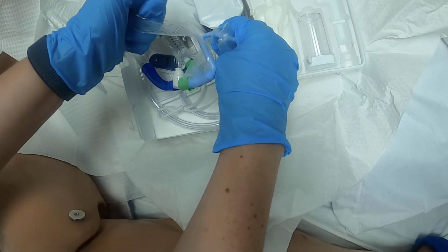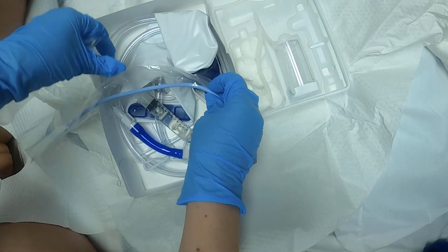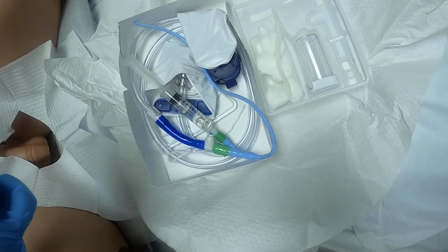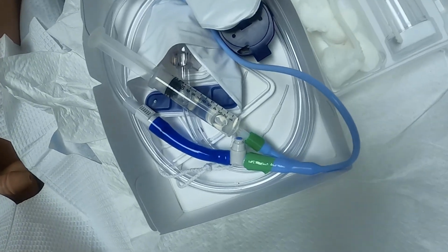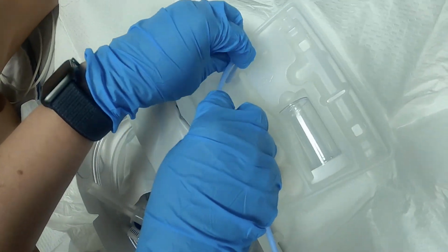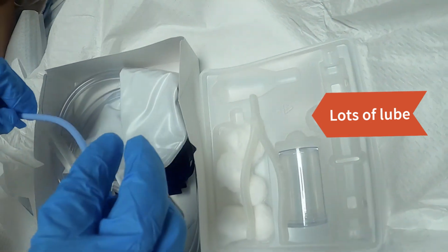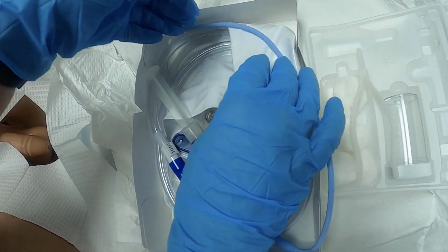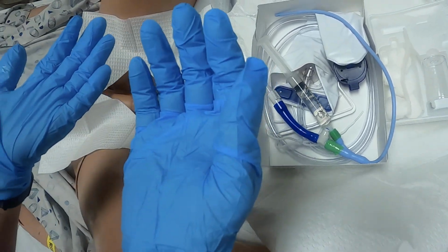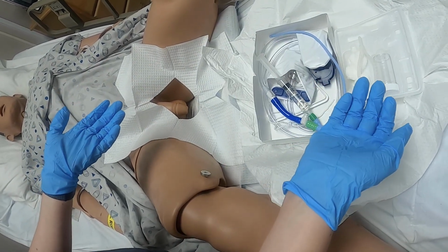Okay, so let's open this all up. Make sure that the catheter does not fling out, right? So it's nice in its box. I'll put this into the trash. And remember, I put my lubricant right in here. So I'm going to make sure this is nicely lubed up. Okay, so this here is all ready to go. Okay, so the catheter is all sitting in here. Once I make a commitment on which hand is dirty, it is dirty and it cannot be undone.